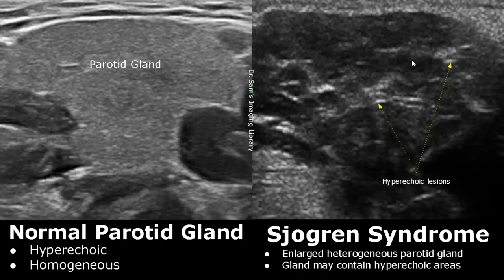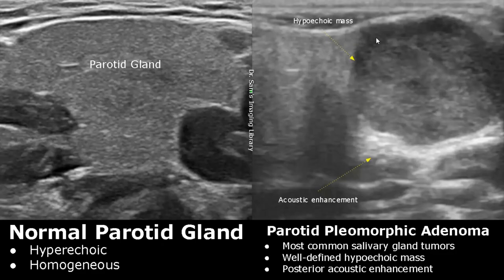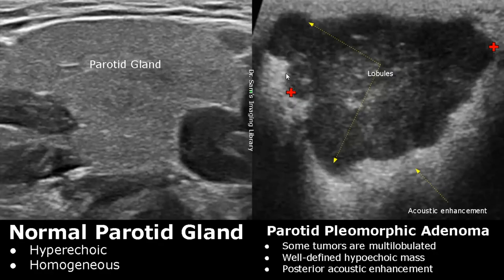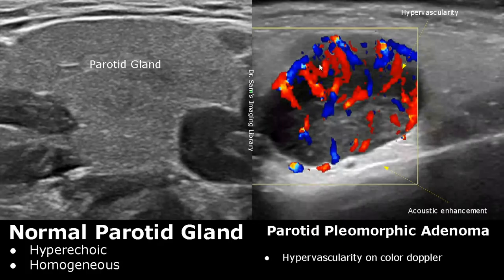Now we move on to salivary gland tumors. Parotid pleomorphic adenoma is the most common salivary gland tumor. We will find a well-defined hypoechoic mass with posterior acoustic enhancement. In some cases, this adenoma may also have multiple lobules or chambers, along with posterior acoustic enhancement. The mass will be hypervascular on color Doppler, with many Doppler signals found within it.